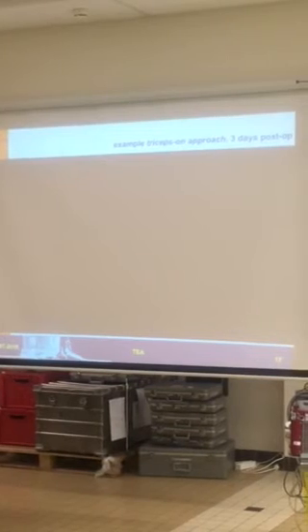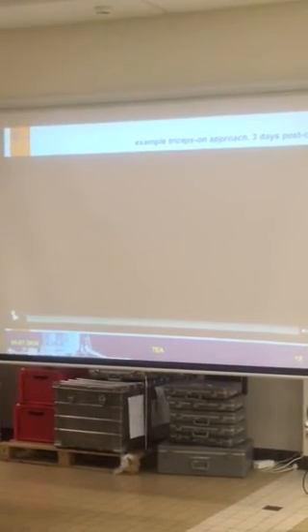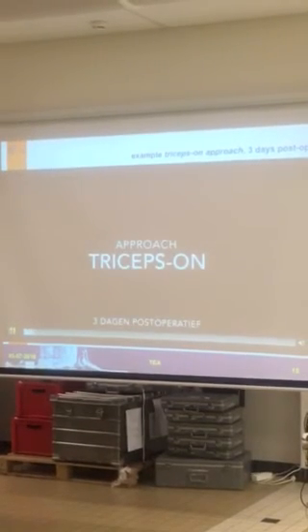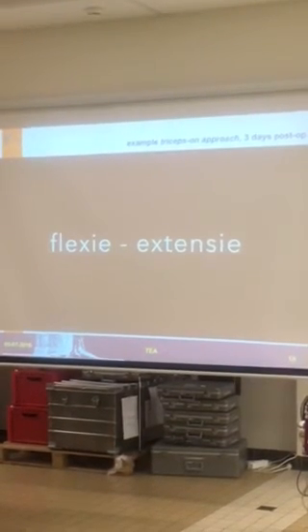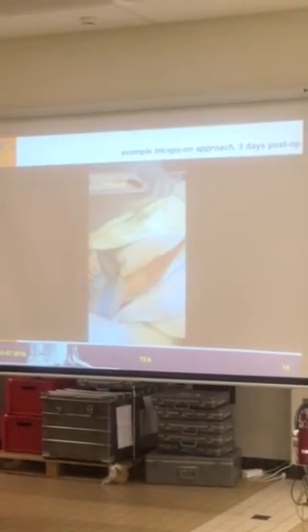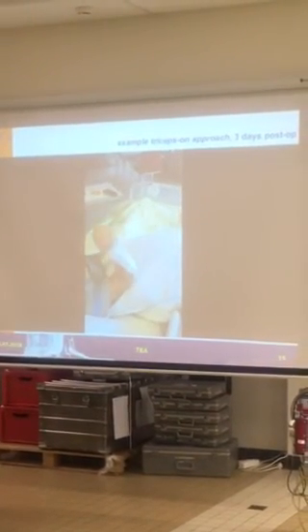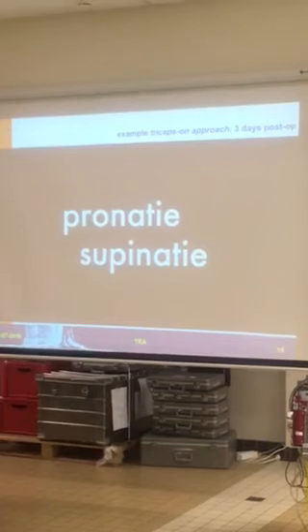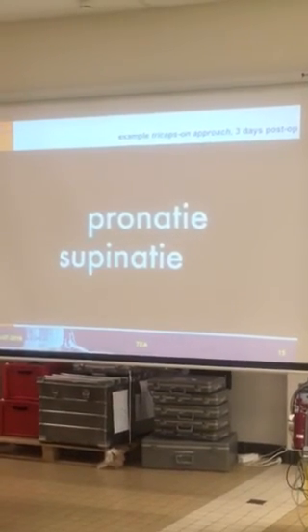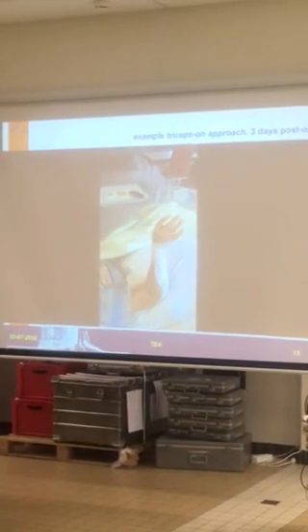And what about how people do with the triceps-on approach? I think this is really working. I have to get the video started. This is what you never see with the triceps split 3 days afterwards, because you put on a plaster and you're very scared that people are exercising too early. This is a patient 3 days post-op, lying on her back in bed, and she can just control her arm without getting hurt. So I think this might convince you to look at the triceps-on approach as another possibility to put in an elbow prosthesis safely. These are her rotations.